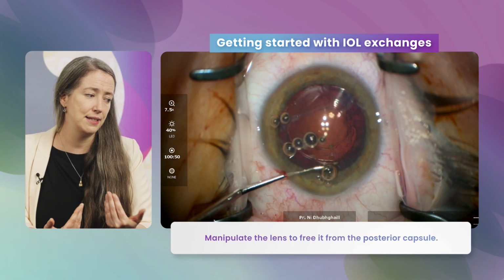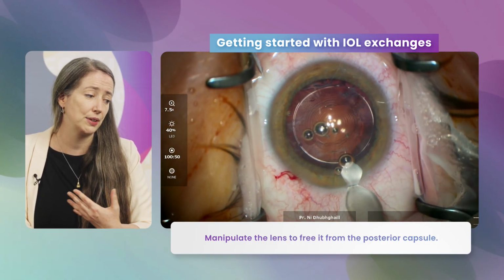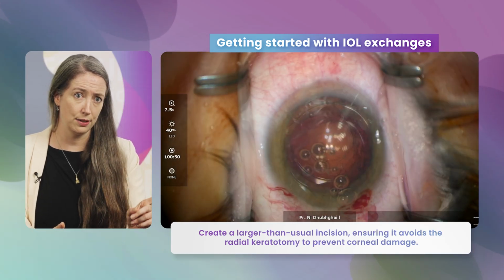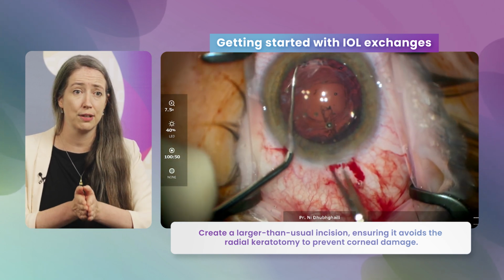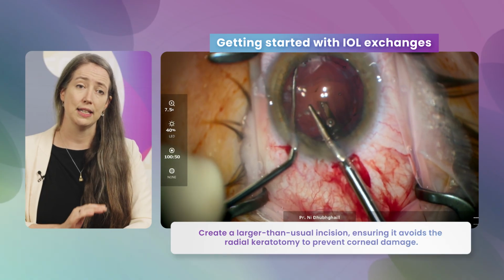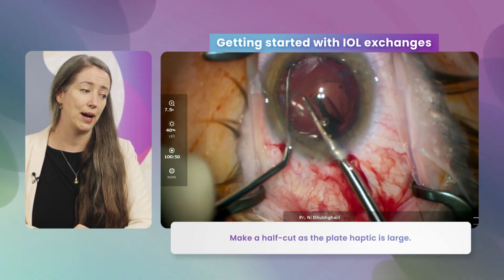I lift the lens into the anterior chamber, free it away from that posterior capsule, and I create a larger incision than usual. The trick here is I have to avoid the radial keratotomies. Radial keratotomies can split, and then you have an irregular and open cornea you have to stitch. So once I create the incision between the 2 keratotomies, I can get cutting my IOL.